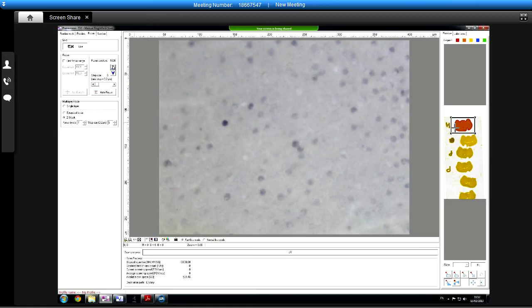I would have guessed before starting that approximately half or a little bit more of the total thickness is our useful information. So about 6 microns. Let's go for 7 to make sure. And to me, as I'm stepping up and down a micron at a time, there's no need to step up in any finer steps.